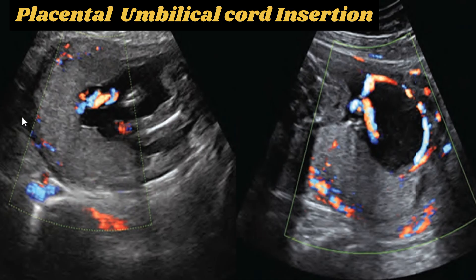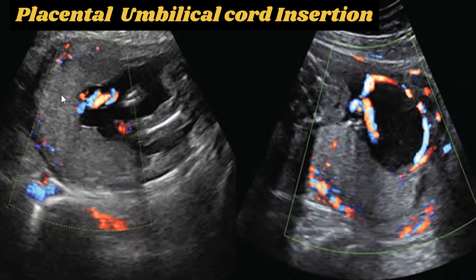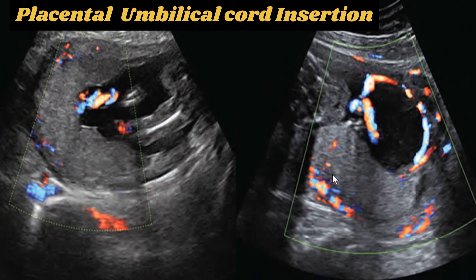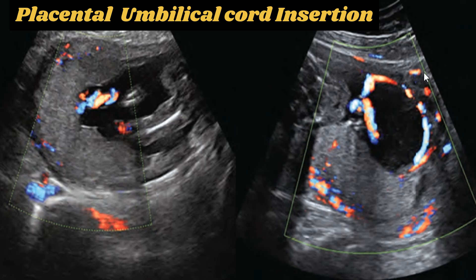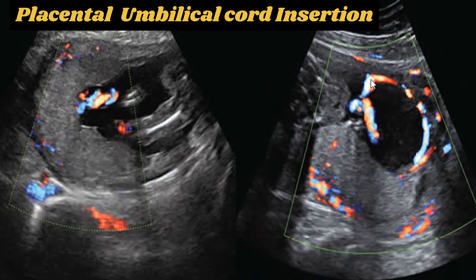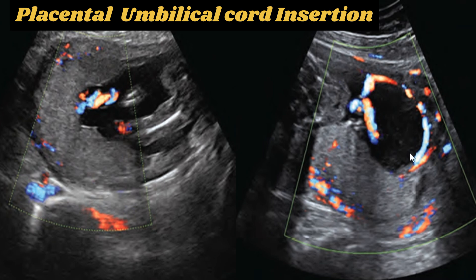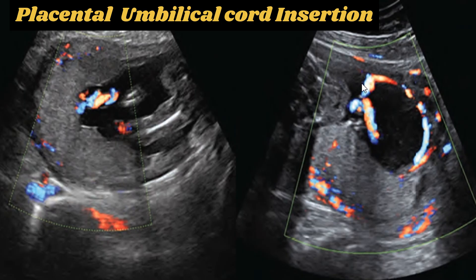In this sonogram we can see the placental umbilical cord insertion. This transverse image of the uterus with color Doppler shows the right lateral placenta with normal insertion of the umbilical cord into the placenta. In the next image, we can see a velamentous cord insertion — this longitudinal transabdominal image shows the umbilical cord insertion separate from the placental substance. The velamentous vessels travel along the membranes of the uterine wall, unprotected by the umbilical cord, to supply the placenta.